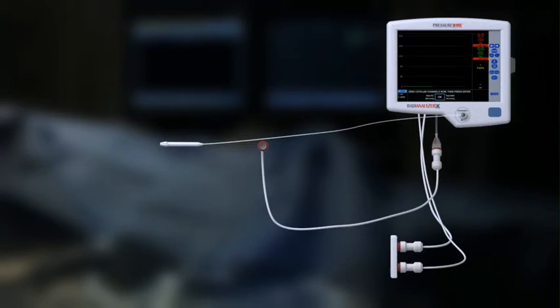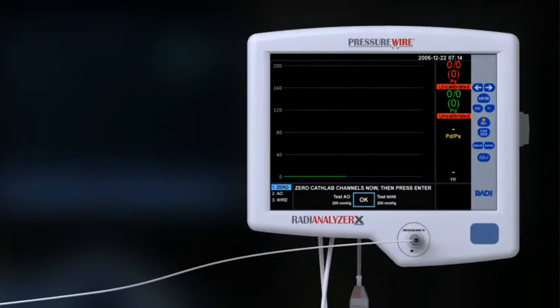When the instrument is turned on, the optional automatic setup sequence is displayed. Begin by zeroing CATLABS pressure channels. Press ENTER to continue.